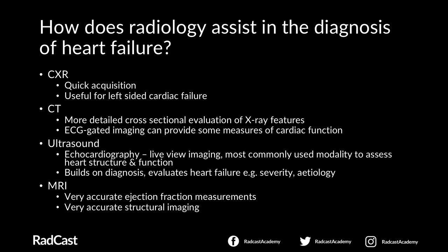This uses ultrasound to obtain a completely live view of the heart, and it is by far the most common imaging modality used to assess heart structure and function. Most, if not all, heart failure patients will have had an echocardiogram performed, or at least have been referred for one. Echocardiography can build upon a patient's initial heart failure diagnosis, and its role can be more to evaluate the severity and etiology of heart failure. Perhaps a patient might have a very stenosed aortic valve, or part of the ventricle wall isn't pumping as it should, aka a wall motion abnormality.